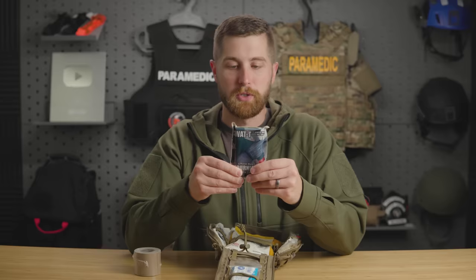Periodically, and I think it's something like 20% of the time, one CAT tourniquet will not be effective for your patient, and they recommend putting on a second one. So you can either carry a second one of these, or I like carrying a backup like this just because it is multi-purpose. And we don't have a ton of room, so I like to save that space as much as possible.